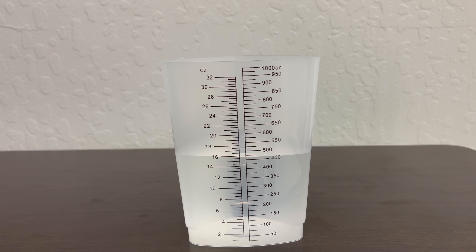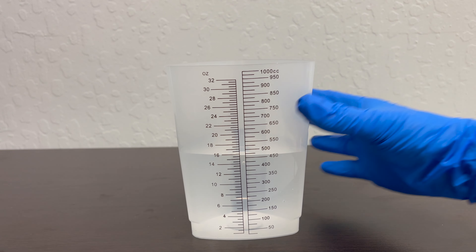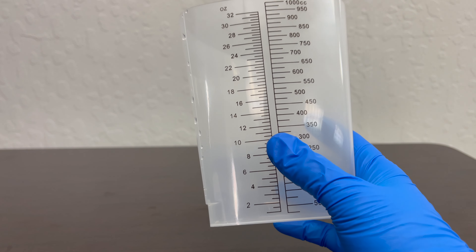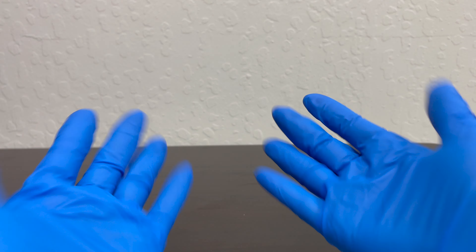After measuring the urine, empty the contents of the measuring container into a toilet. Rinse the measuring container and pour the rinse into the toilet. Before you record the output, don't forget to remove your gloves.